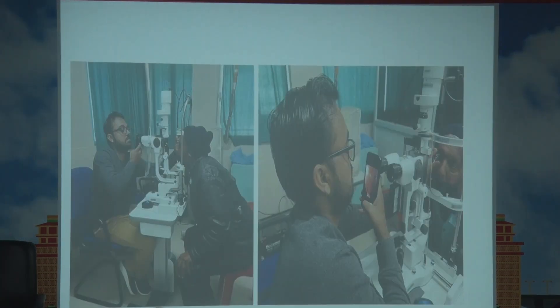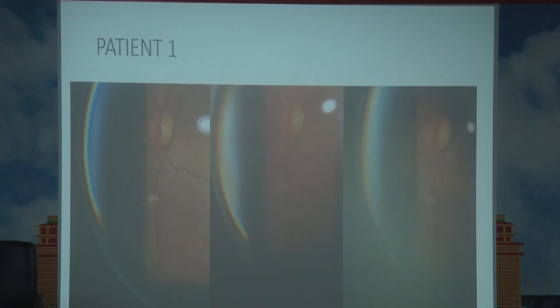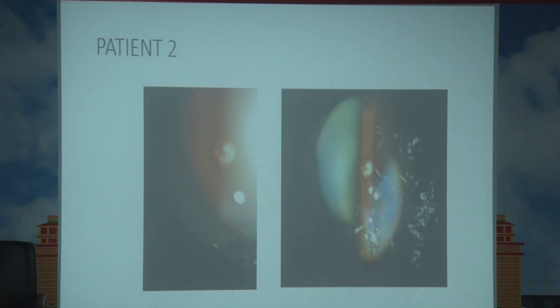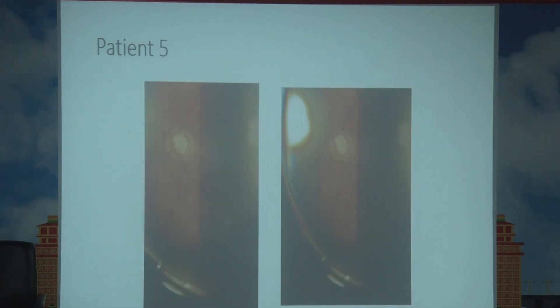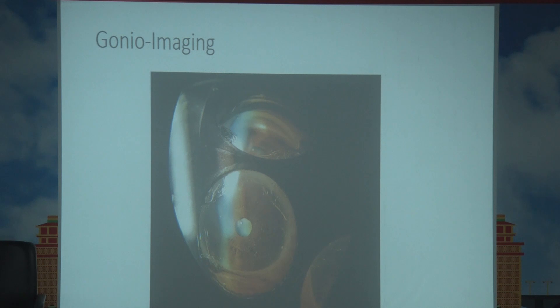This is me trying to take the picture of the optic disc using the 90D lens and a smartphone with a slit lamp biomicroscope. This is the first image; the patient followed up after one or two weeks. This is the second picture of the same patient at one month follow-up. This is the third, fourth, and fifth — showing that if you can do this imaging with a smartphone, you can also achieve good results.